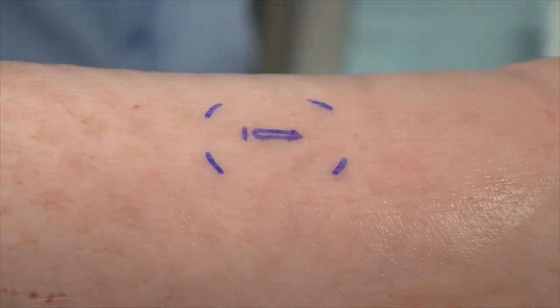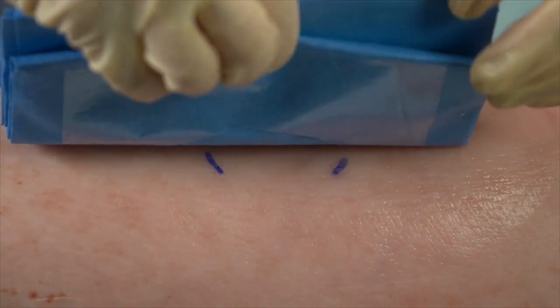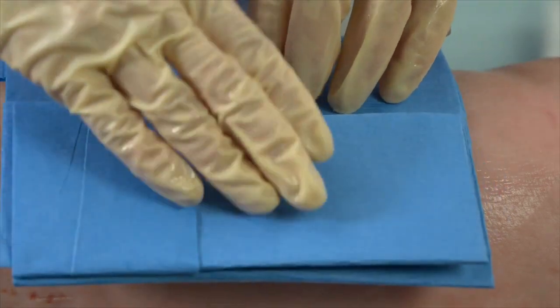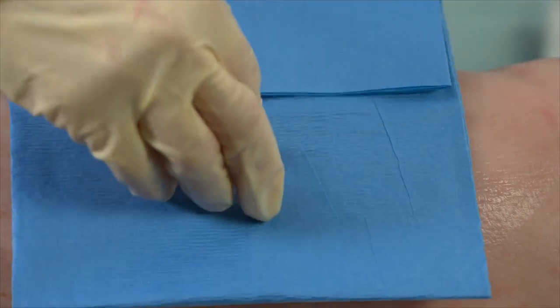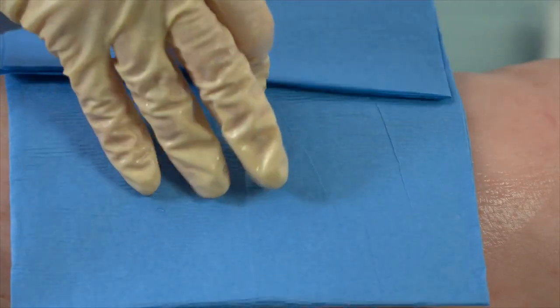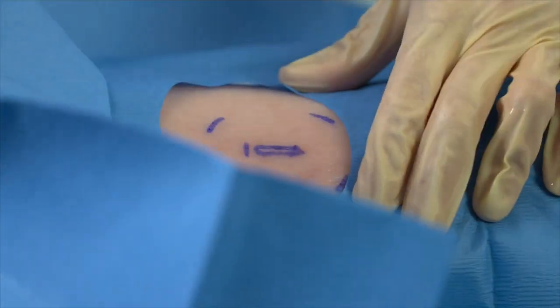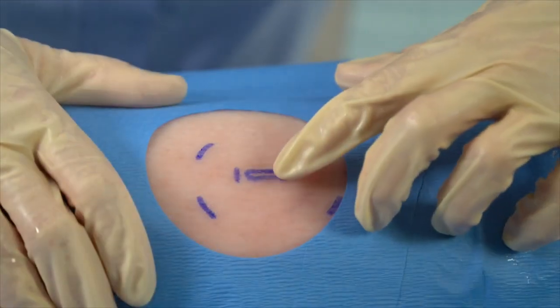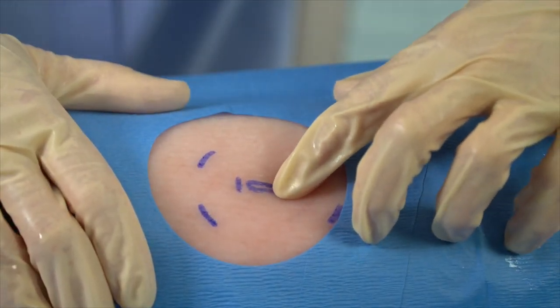Align the proximal curve of the aperture with the proximal markings of the smart transmitter. Place the aperture of the drape, adhesive side down, over the incision area. Then carefully open the drape, maintaining sterility. With your non-dominant hand, push down the sensor's proximal end to stabilize it.